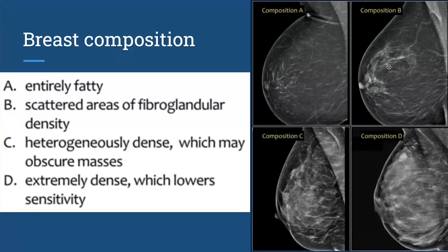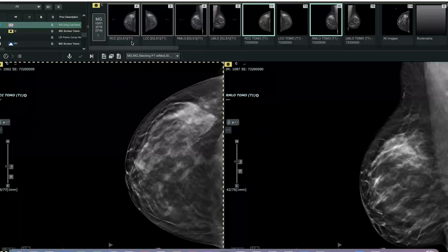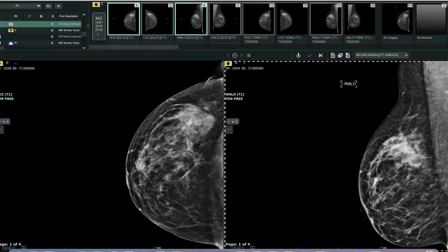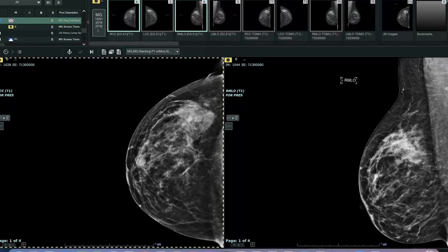I want to show you an example case where the 3D tomosynthesis mammograms can help us see a little bit better through your normal dense breast tissue. This is the case of a woman who had a bilateral screening mammogram. I'm showing you just the right breast images here. This is the 2D mammogram, and the patient was brought back from her screening mammogram for two question findings in the right breast.